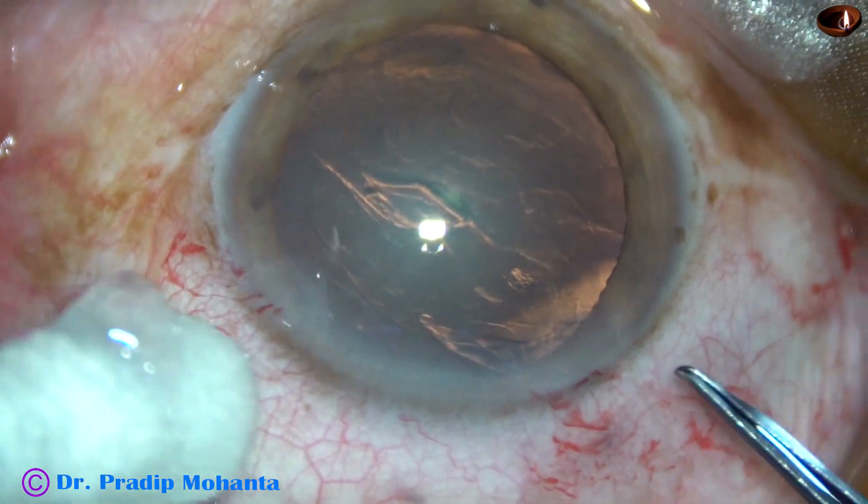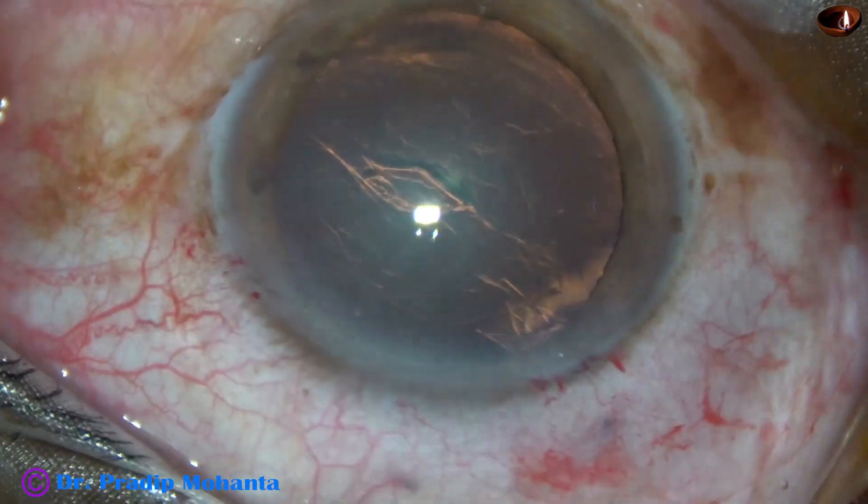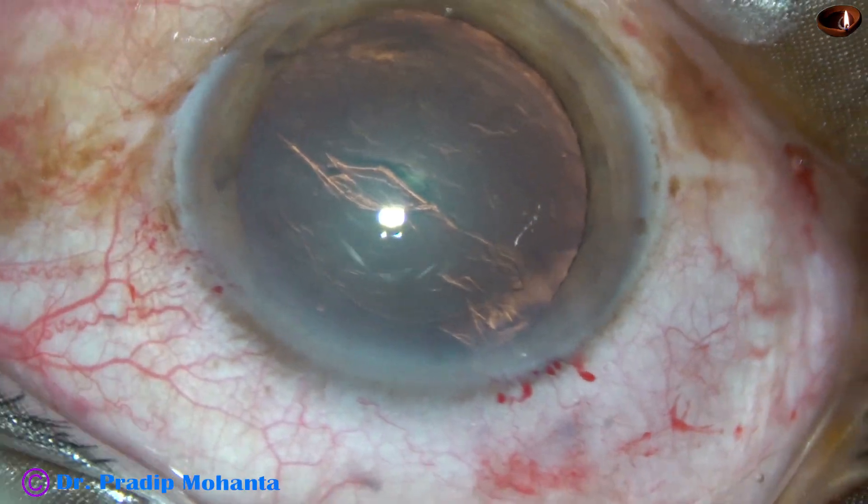For the lens tilt technique, we need to achieve a rhexis of about 6 mm.